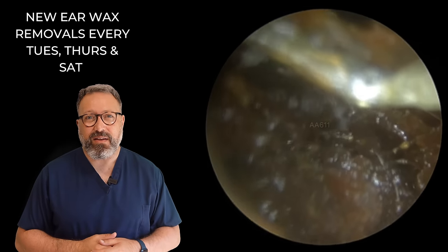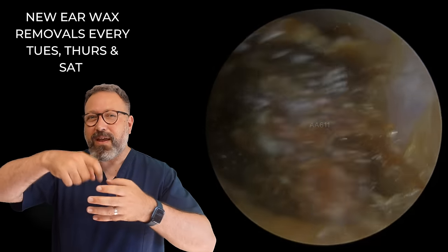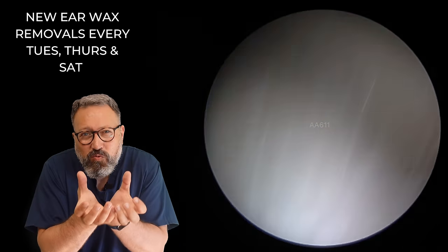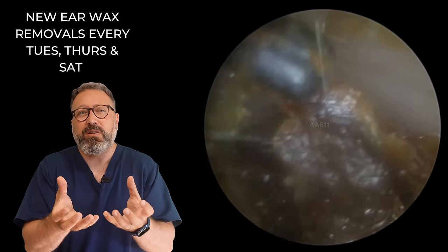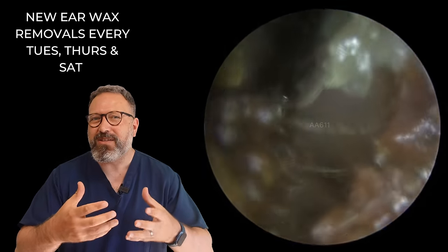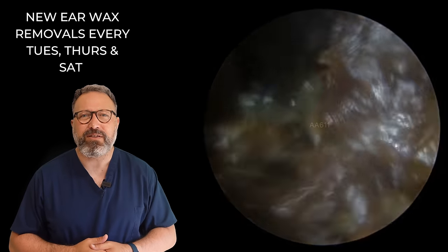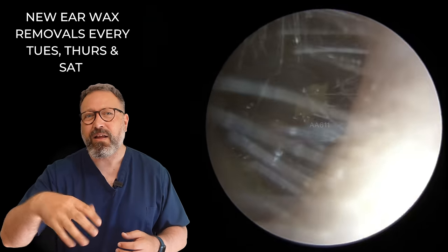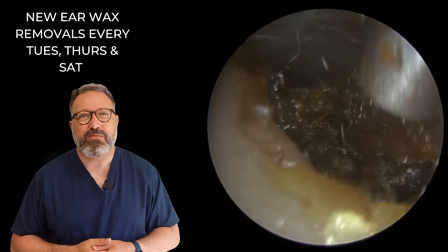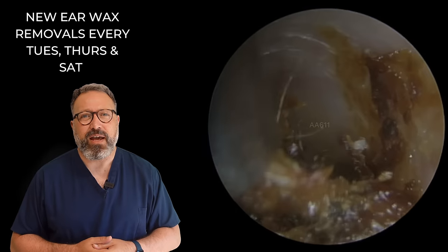We've got behind it — I'm pulling forward. You can see it's starting to loosen, but what's happening is the bend on the hook itself is just pulling straight through the middle of that wax. The bottom section is really tough and holding on to the bottom portion of the ear canal, but this top section is still that softer, stickier material we found in the center of this wax. I'm just using the side of the hook to see if we can pull this down — aiming to get some of the harder material at the base of the canal to move forward. But it's just loosened up so much stuff in there. Let's start removing some of this looser material from the edges.